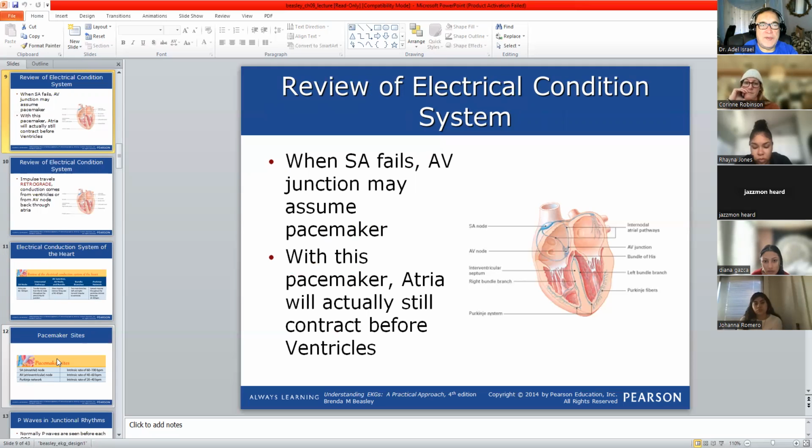So order is very easy. We repeated this many times, like we repeated the names of the waves many times, so it is not acceptable for any of you to make a mistake calling the name of a wave.